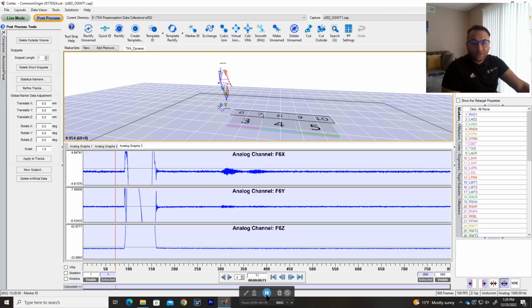Hello, welcome back. So we just got done with the 200 series, and in these 300 series, we'll dig deeper into how to troubleshoot some common problems in data collections of, like, motion capture data collections.